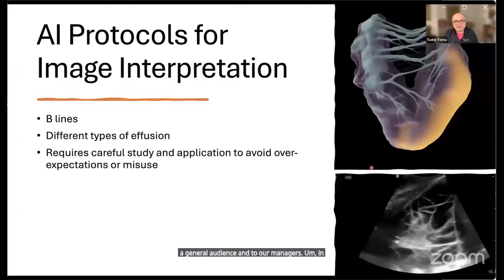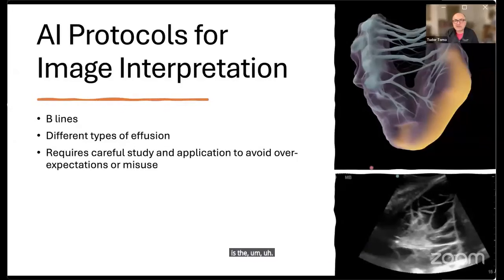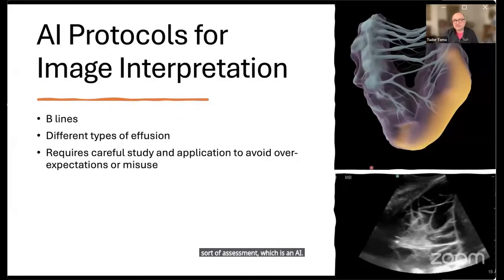In terms of AI, a field which is very close to my interest and heart is the possibility to expand the image interpretation with AI. And at the moment, we have this B-line assessment, which is an AI assessment of B-line.